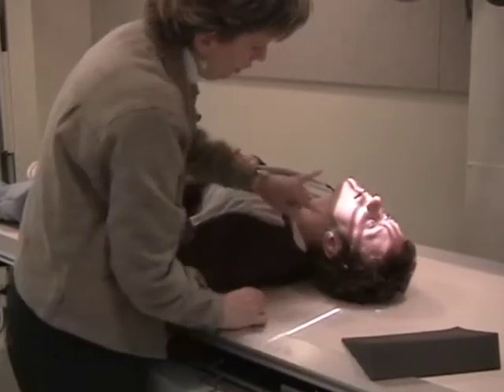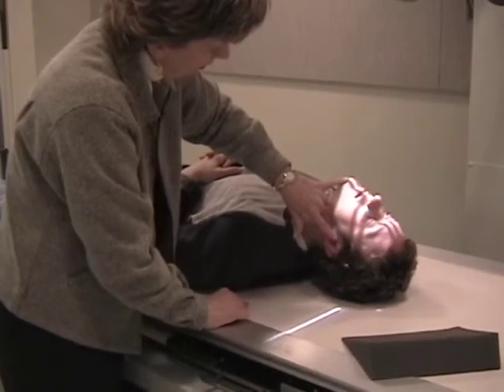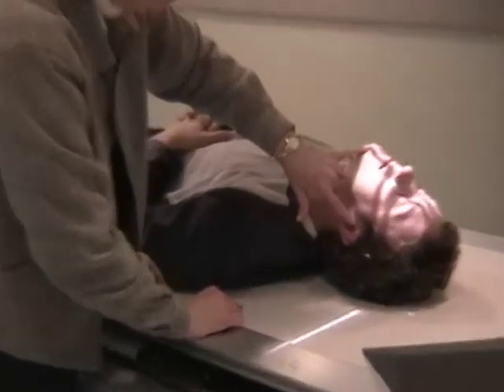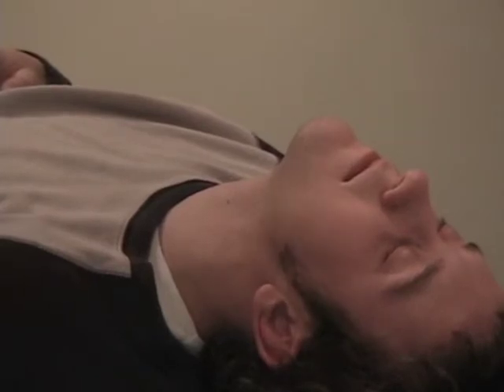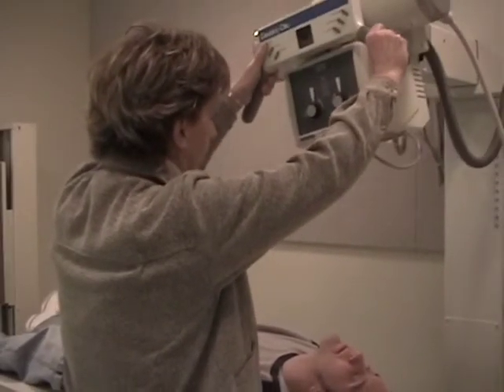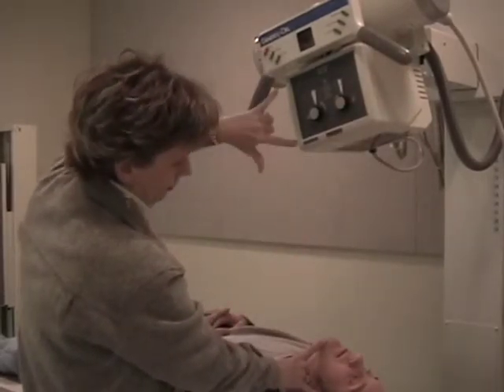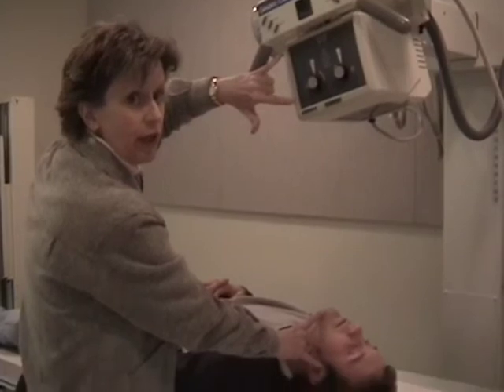He can extend his chin, but take a look that the mental meatal line is not truly perpendicular. Okay, I think you can see that. If it was perpendicular, it would be parallel to the central ray. Well, if I can't get the patient to be perpendicular, I'm going to adjust the tube, and I'm going to put a caudal tube angle on there to match that mental meatal line. Can the camera see the two things here I'm trying to do?